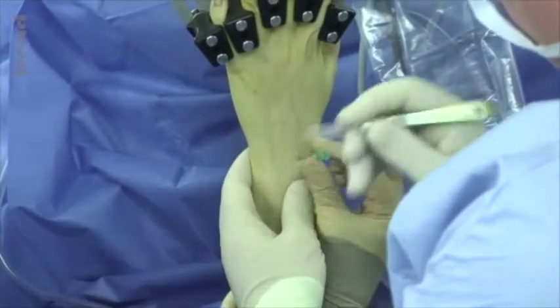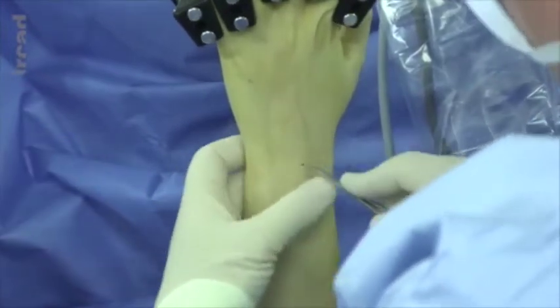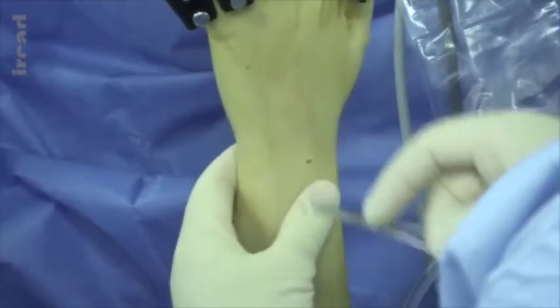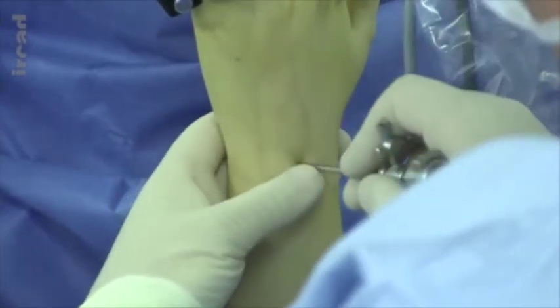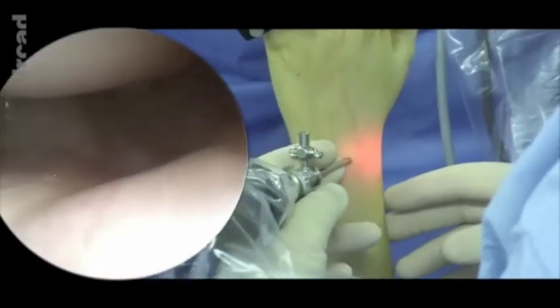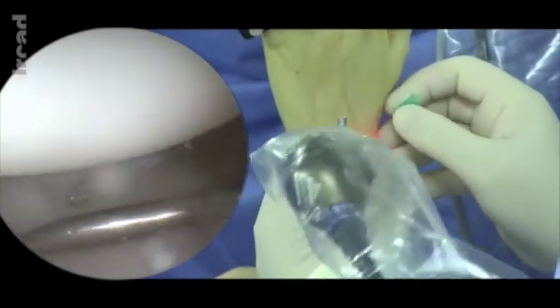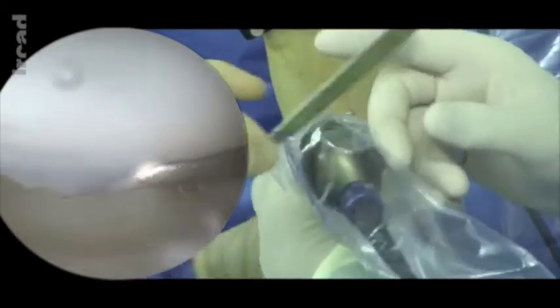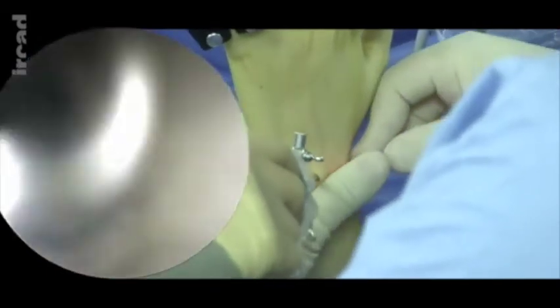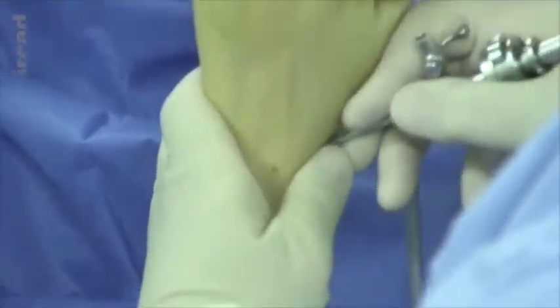A conventional and routine 3-4 radiocarpal portal will be used. A small incision is made using mosquito forceps prior to the placement of the arthroscope. The arthroscopic guide will be placed first and the arthroscope can then be used to directly access the scapholunate ligament, which is intact in the present case, just as the interosseous membrane. A 1-2 radiocarpal portal is then used, which will allow for the placement of the scope. The 3-4 portal will be used only for the passage of surgical instruments.